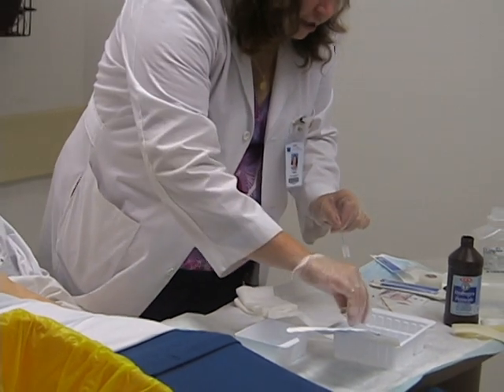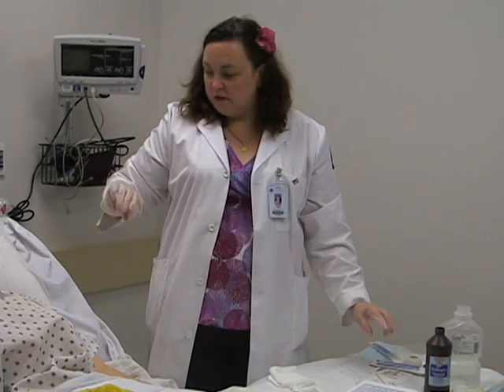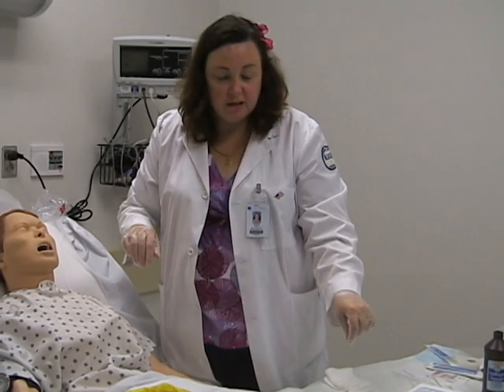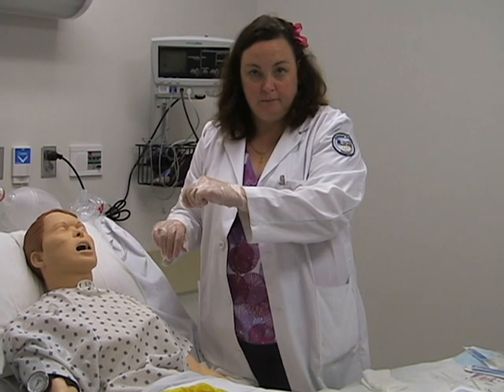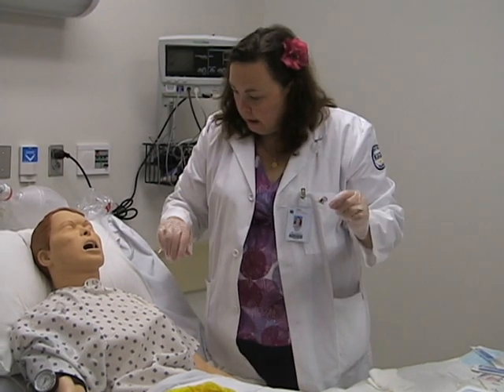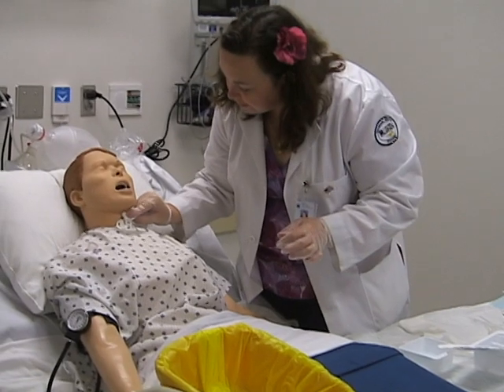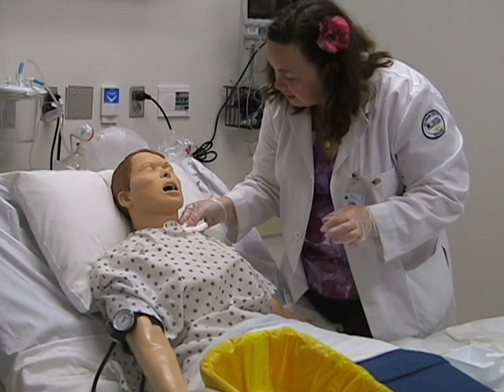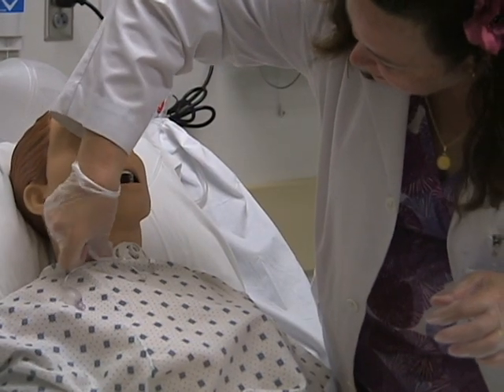Some facilities will actually have a sterile cannula ready to go back in when you do your trach care, so that when you take the dirty one out you drop it in to clean and you have a fresh one to put back in. Again, refer to your policy and procedures manual. You can use extra gauze to clean around to make sure that the face plate stays dry.